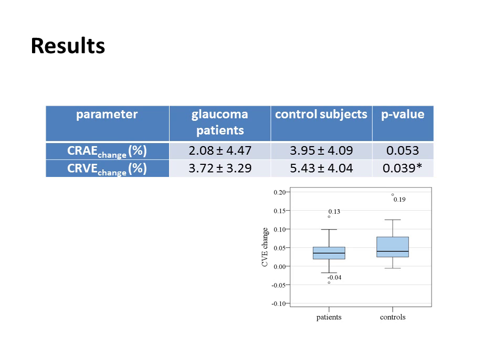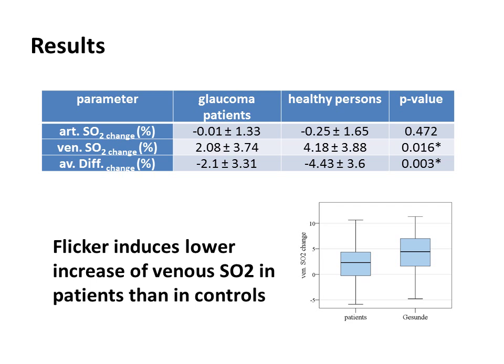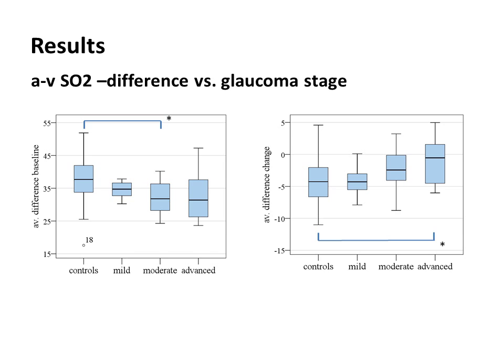And what we found was again a decreased flicker response with respect to the diameter, especially in the veins, but also a decreased change of the venous oxygen saturation, as well as the arterio-venous difference.